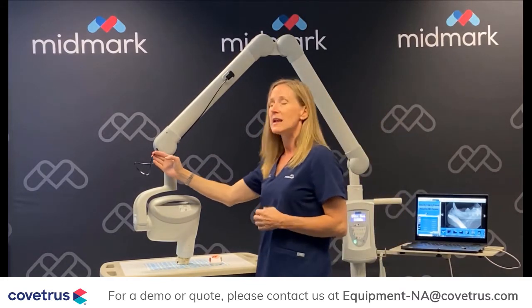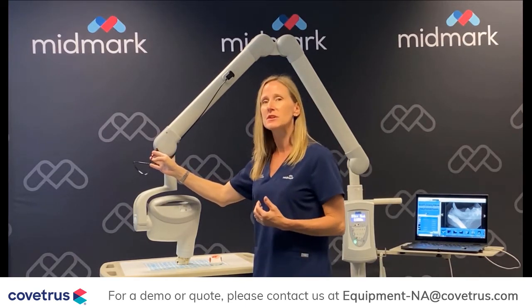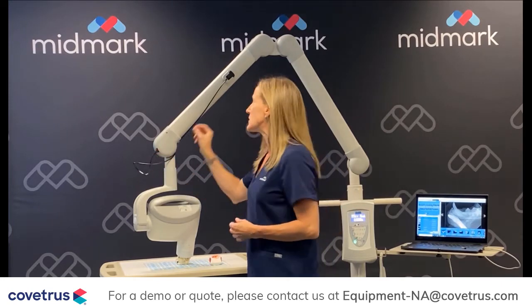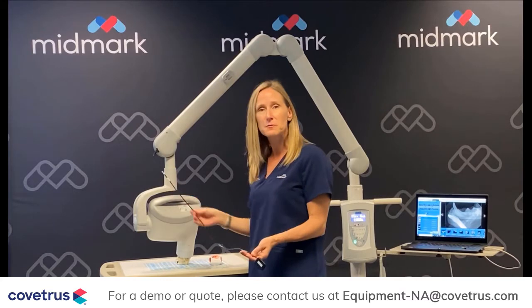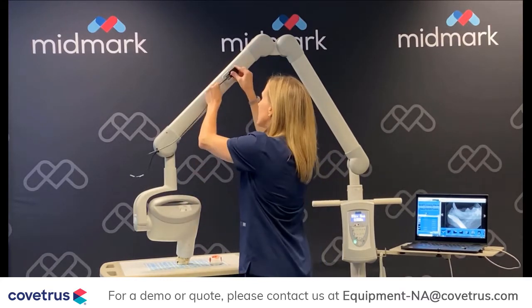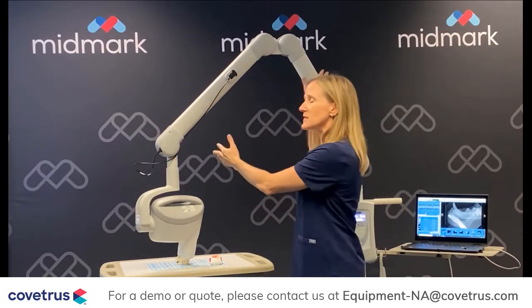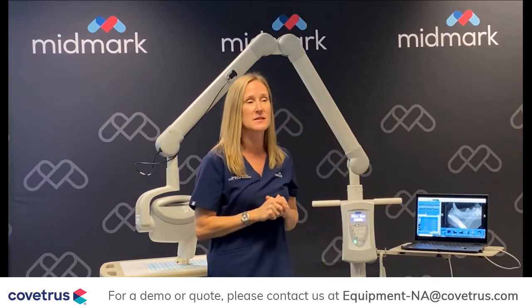The other thing that we did — and if you're going digital — we added the option many years ago to plug the sensor into the arm of the x-ray. What this does is it keeps the sensor really safe. It prevents it from dropping on the ground. Storage-wise, you know where it is at the end of the day. You keep it right here and it's very efficient. Those are some things with our arm design to keep in mind when you're looking into dental x-ray systems.